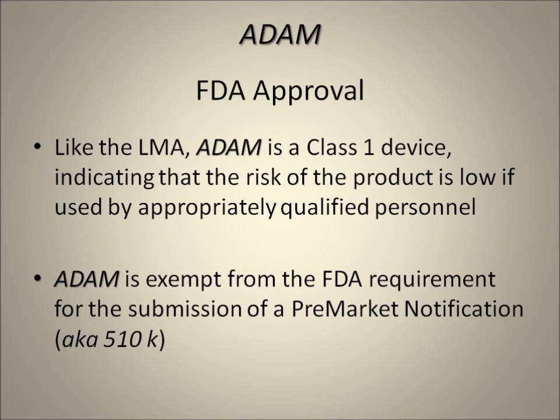ADAM FDA approval. Like the LMA, ADAM is a Class 1 device, indicating that the risk of the product is low if used by appropriately qualified personnel. ADAM is exempt from the FDA requirement for the submission of a pre-market notification.